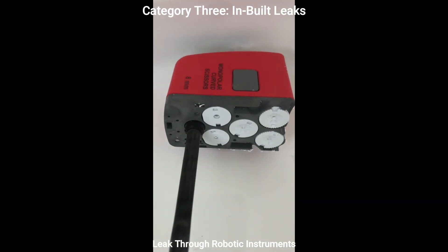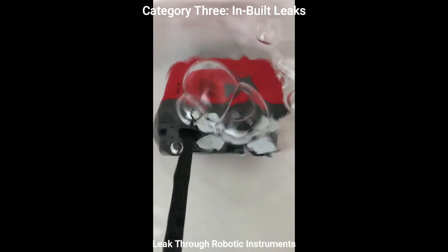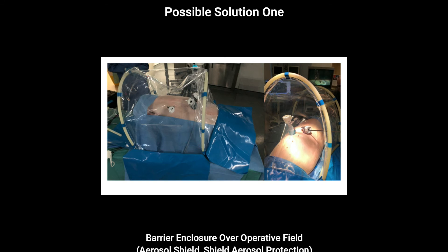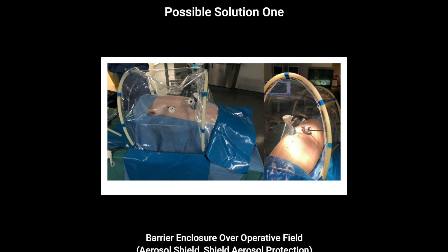It's clear that leakage cannot be obviated by optimum current technique alone. One possible way to manage all the leaks occurring throughout a case could be placing a barrier enclosure over the operative field, although this is not likely to be practical as it will dictate trochar placement and impair instrument movement.